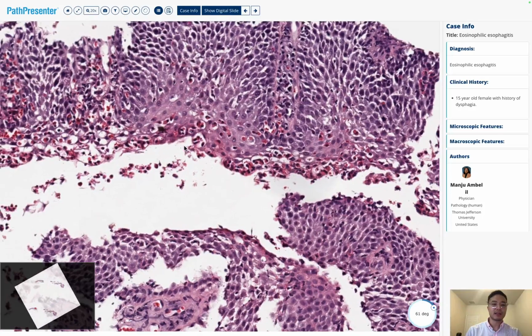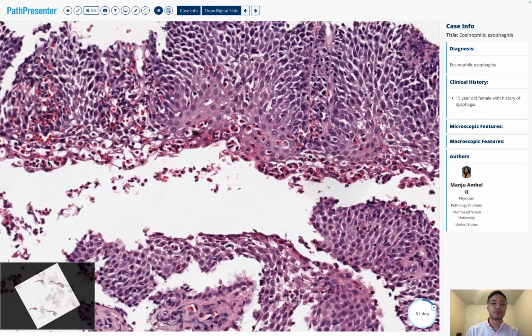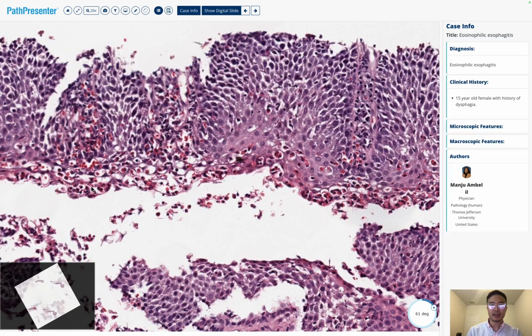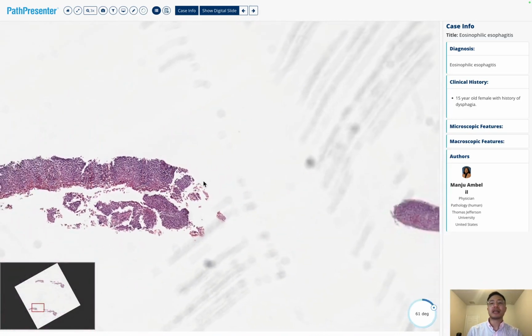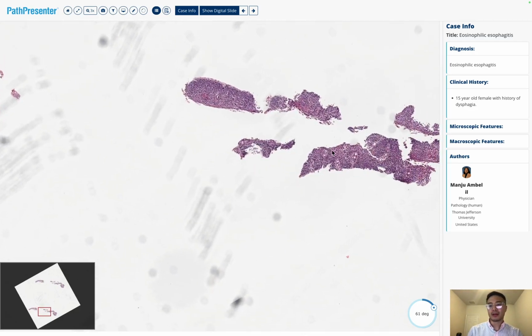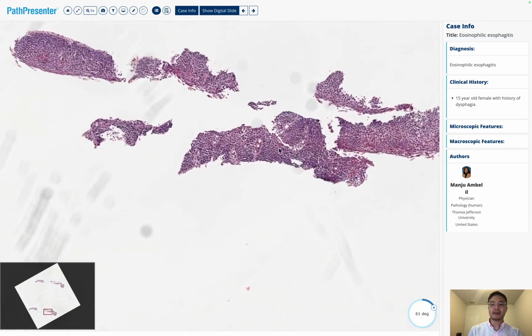So here, I'm not going to even count. There's more than 15. We asked one of my staff, who's GI fellowship trained, what his threshold is for us to stop counting. And for him, a good number is 50. Once you get to 50, you won't change the management by counting more than 50. And it takes time to count more than 50.